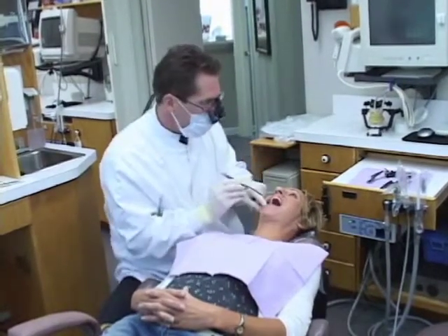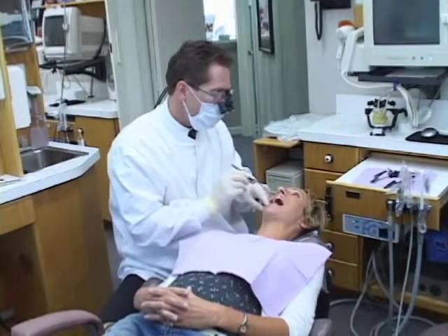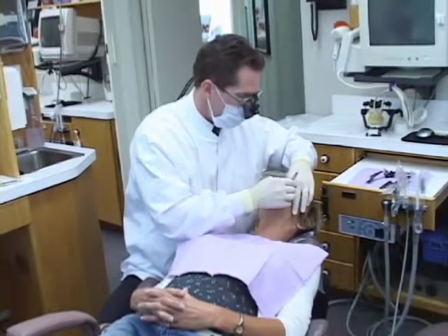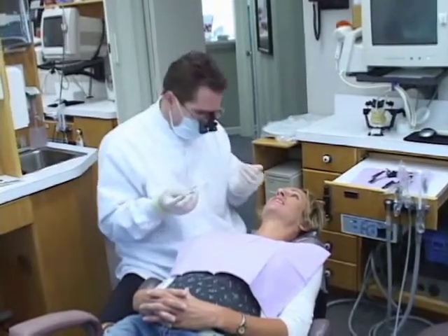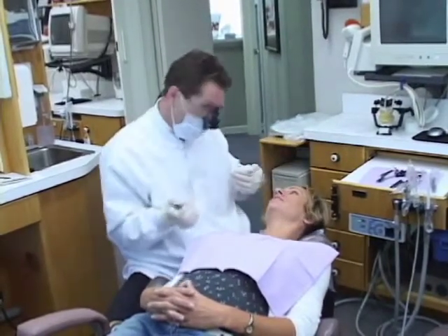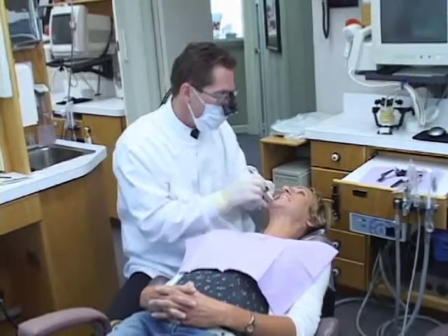To confirm where we're contacting here, go ahead and close. Just exactly what you found in the models. Among other things, this is nice because it gives me more confidence and confirmation that what we've done here is the reality of what's going on. And just to show everybody that you are contacting — go ahead and close. Squeeze. Good. There's nice contact there.